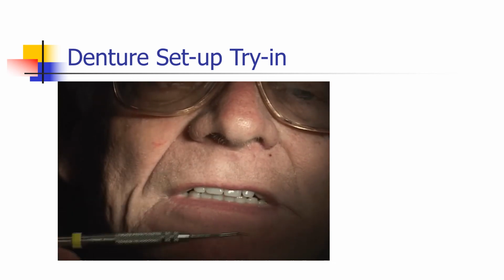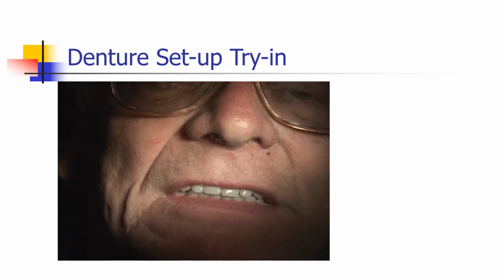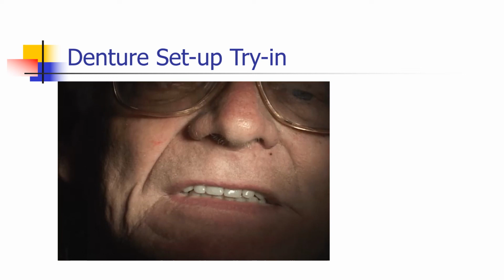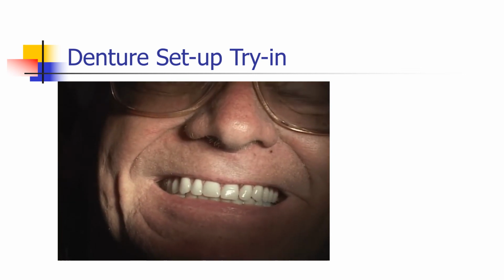And we've given him good facial support with this denture, and I'm pretty happy with it. A big smile. That looks pretty normal to me.